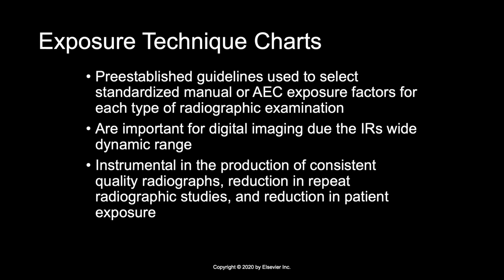So technique charts are pre-established guidelines used by radiographers to select the standardized manual or AEC exposure factors for each type of radiographic exam. The technique charts are going to standardize the selection of exposure factors for the average patient.